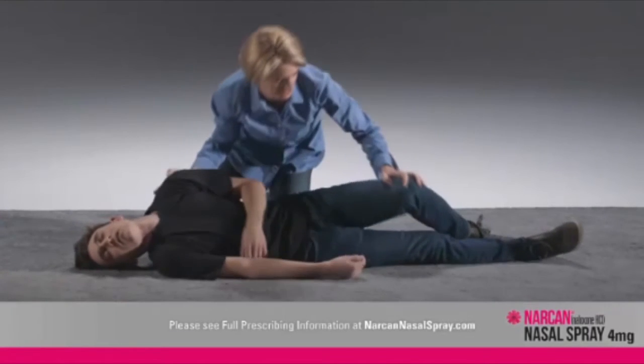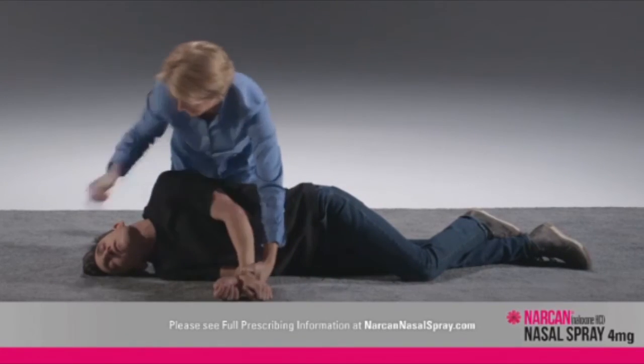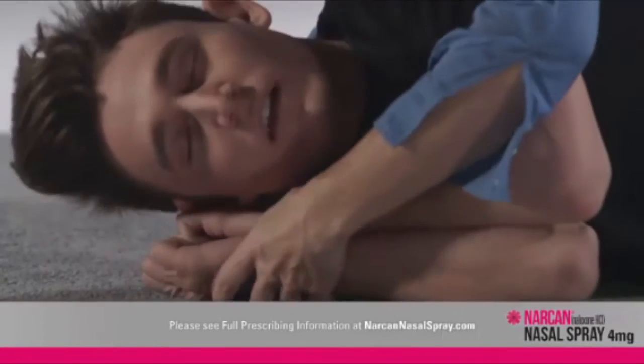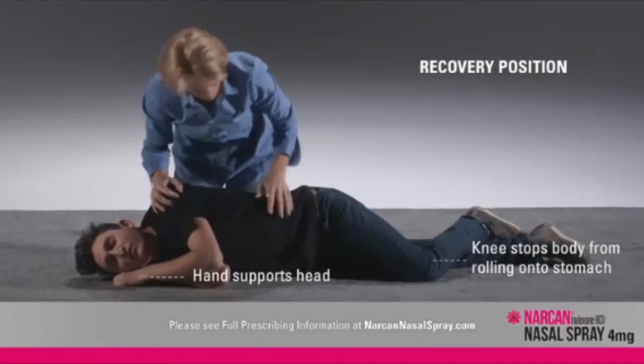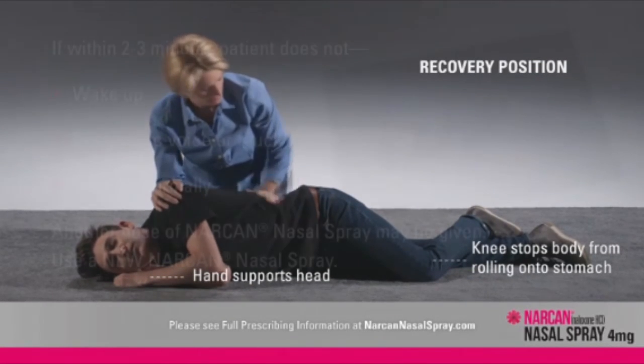Move the person on their side after giving Narcan nasal spray. If possible, put their hands under their head and bend their upper leg forward. This helps prevent the person from rolling onto their stomach. This is known as the recovery position.